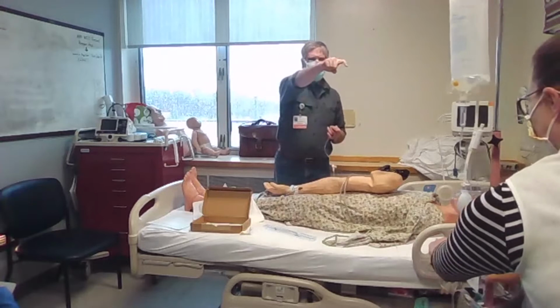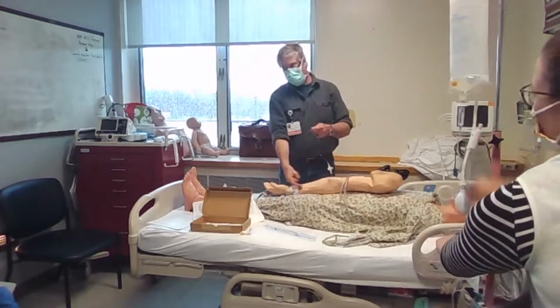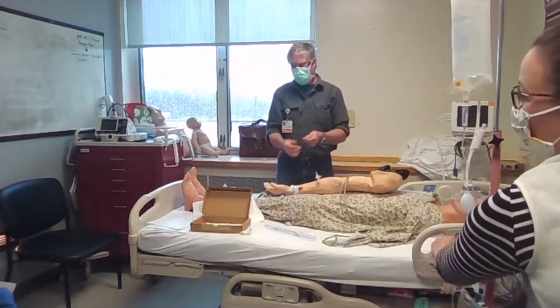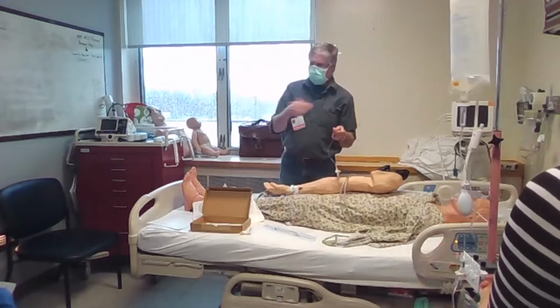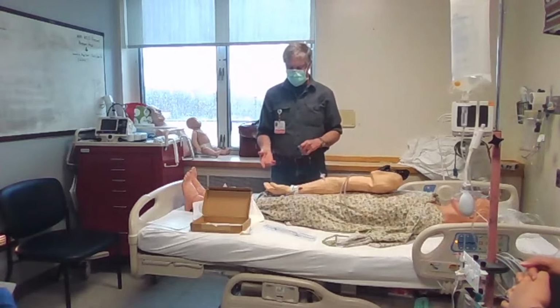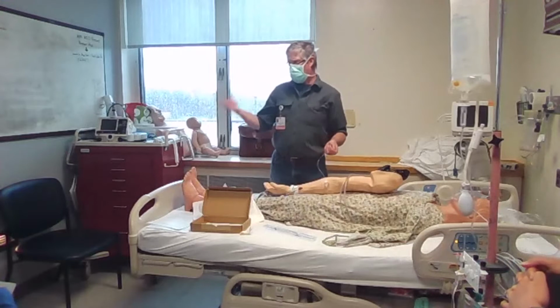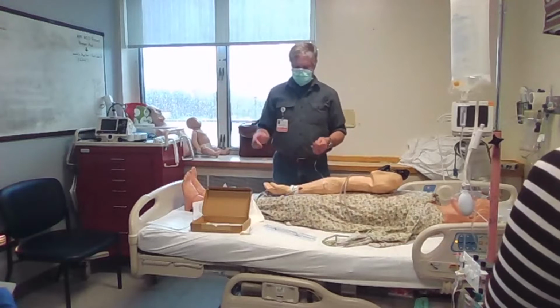When you flush it, you're going to deliver fluid at whatever pressure you've got there into the radial artery, and it just comes out a little bit, but that's enough pressure to kind of clear the tip of the catheter. So I flush them like crazy if there's anything that I think is weird about them. Another thing you can do when you flush it is determine the damping ratio that it has, but we're not going to go into that.